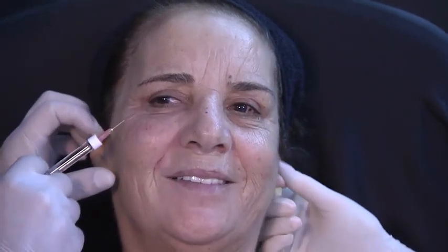And what I'm going to do now, I'm just going to make sure that I'm not too superficial. The only problems that I have seen with Vital is a too superficial deposit in the skin. So I make my patient smile, right. So now I can identify where she needs a little bit more support. Relax, relax. Can you tell her to relax?